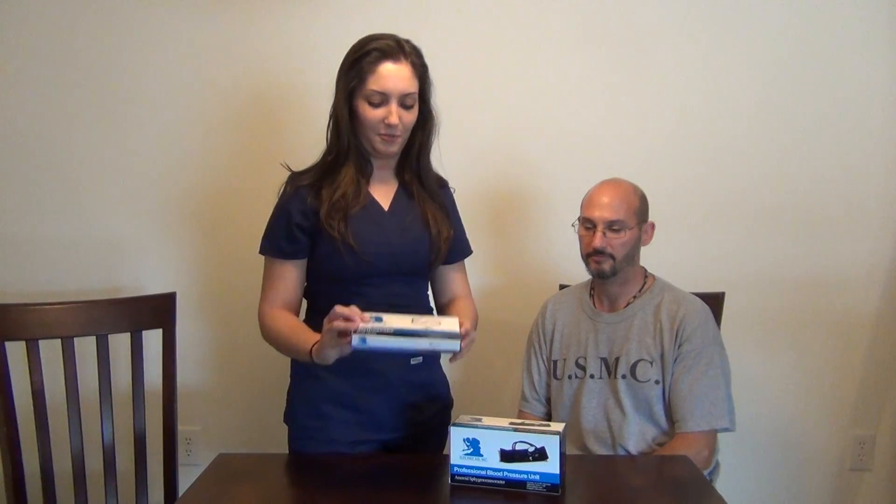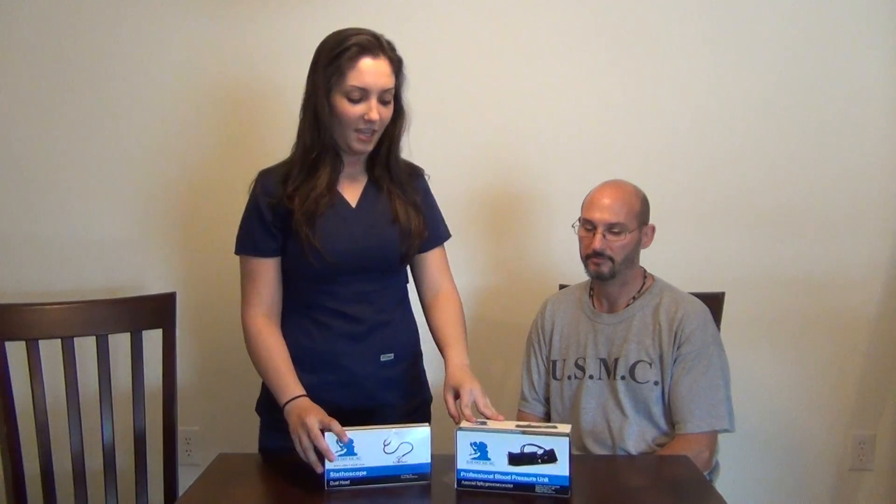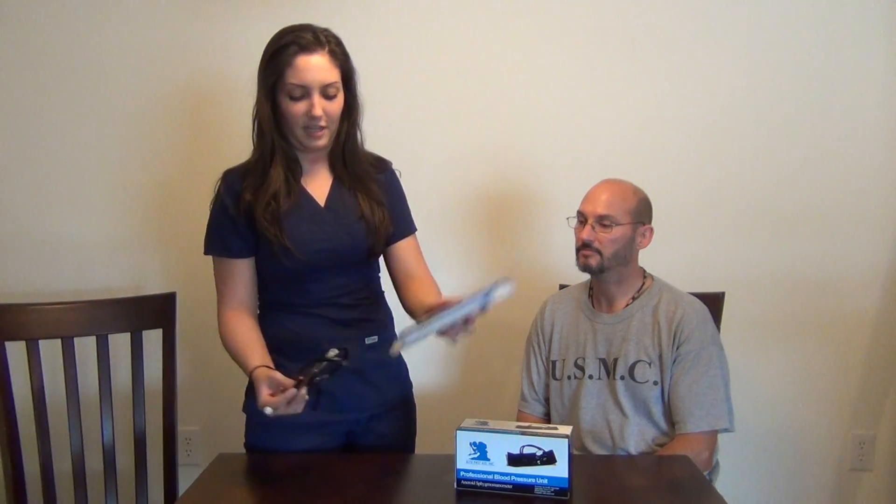Once again, I'm Alicia Shaka. And today I'm going to be showing you how to use the stethoscope and the blood pressure cuff that you can find at campingsurvival.com. So first, we're going to start by seeing what's inside the stethoscope box. You take everything out. You'll find a tubing that connects the headpiece and the diaphragm. And you're going to take the diaphragm, which is the bottom part that you use to listen, and insert it in the tube that has just one hole at this end.